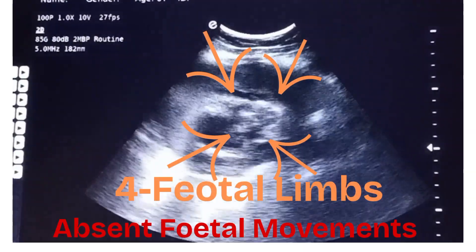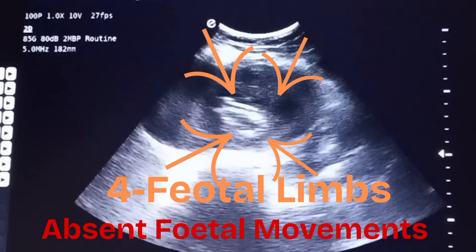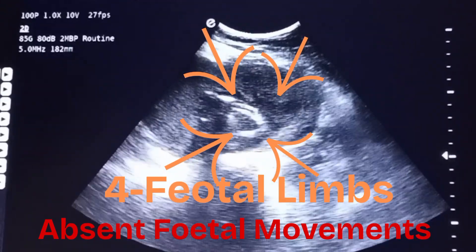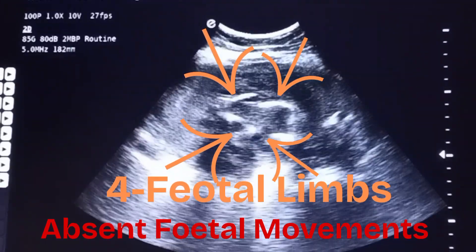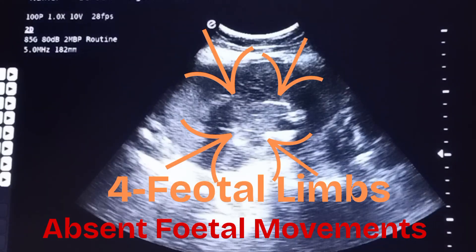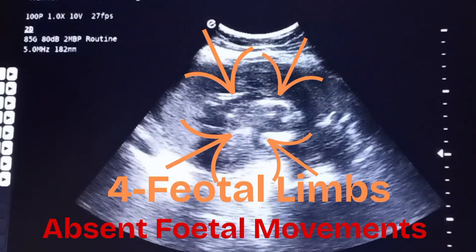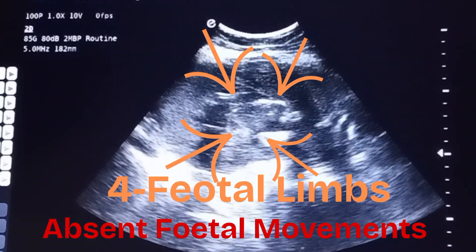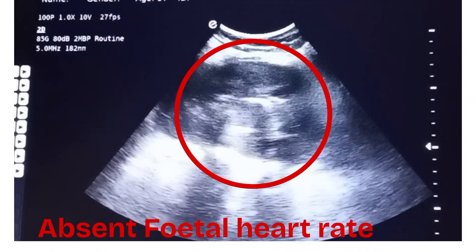Here all four fetal limbs can be seen clearly, with each yellow arrow showing one limb of the fetus. All four fetal limbs are silent, confirming absent fetal body movements.